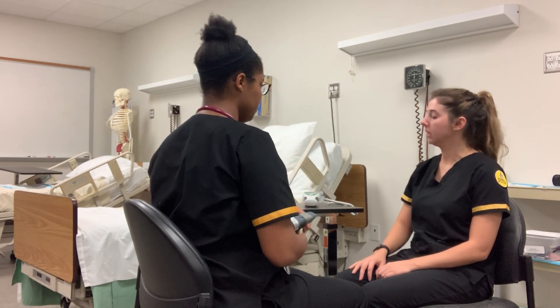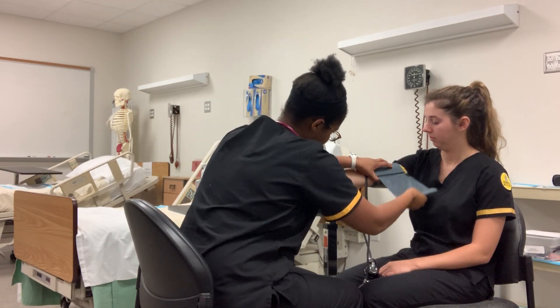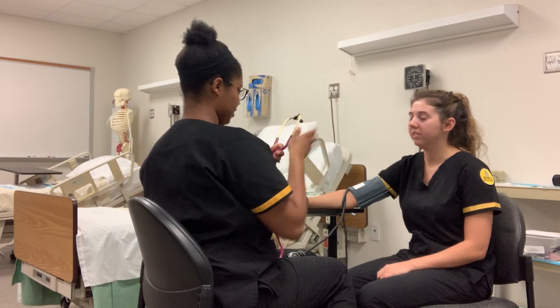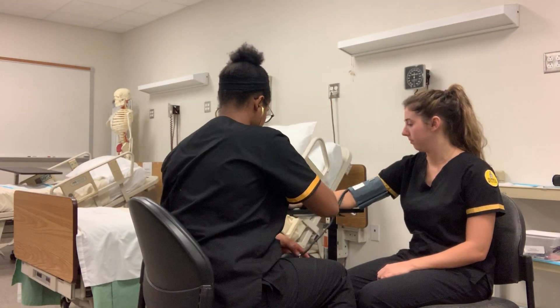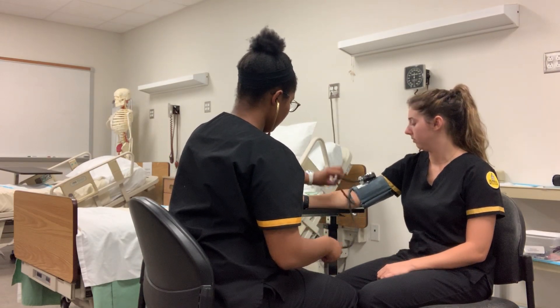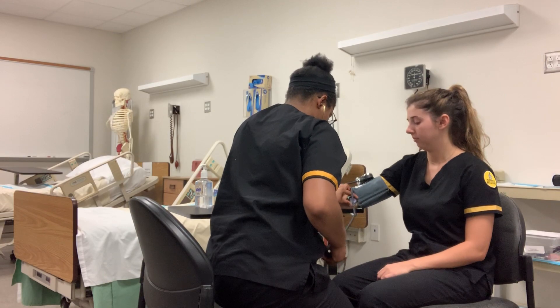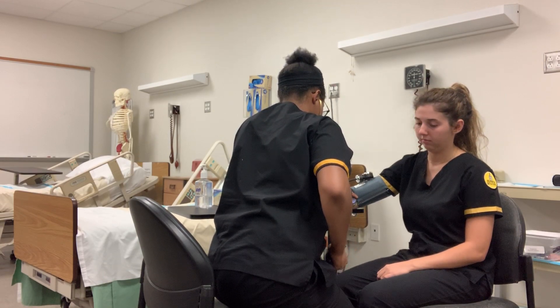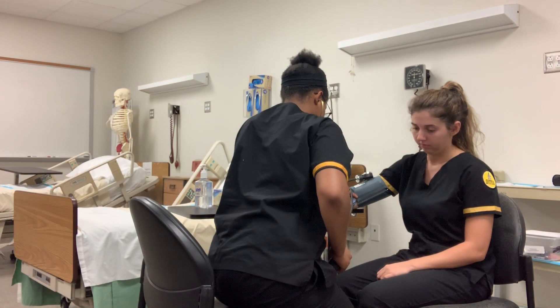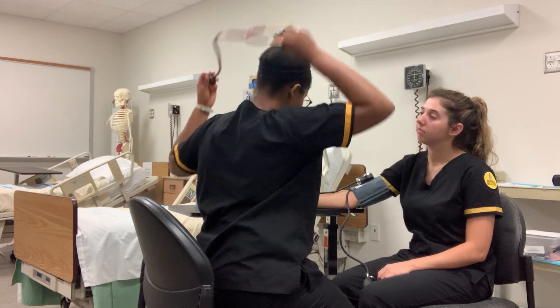Now I'm going to go ahead and do your blood pressure. I'll do it on your right arm. Did you have any pain today or did you just come in for a general check-up? I'm just coming in for a general check-up — I come once a year. This should be relatively painless. If you feel any discomfort or pain, just let me know and I'll stop the procedure. Your blood pressure is 118 over 70, which is within normal range.